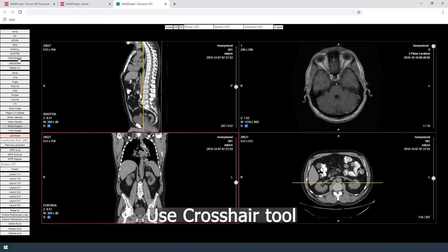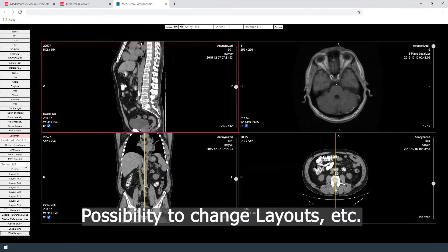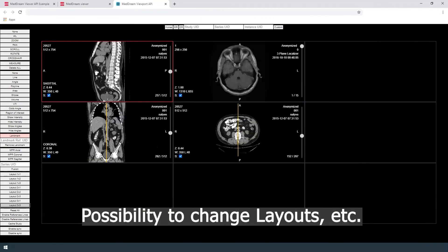The crosshair tool is available as well, along with the possibility to change layouts.